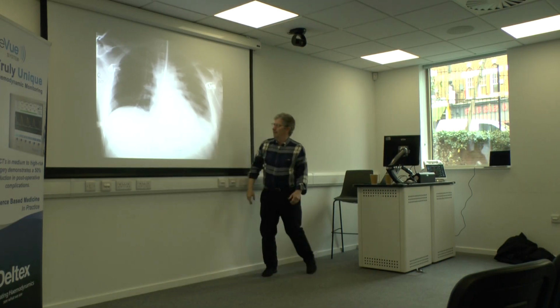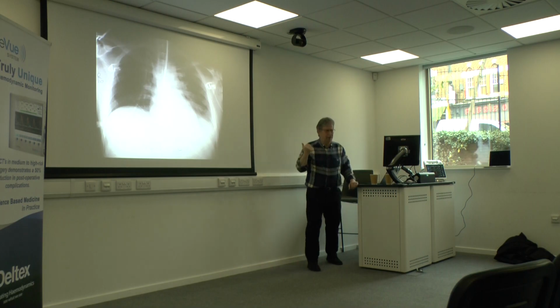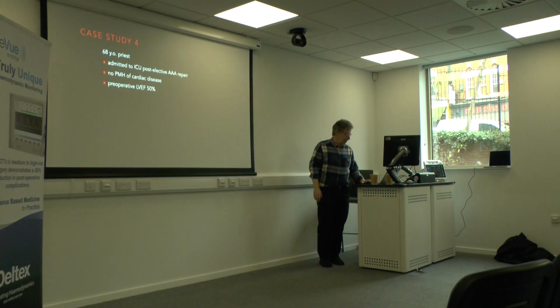Yeah. So again, it's just having that information. Because he was actually quite shut down peripherally, so I was surprised that it was 20 litres per minute, but it was all central. He was all shut down there, but he had a very high central circulation.